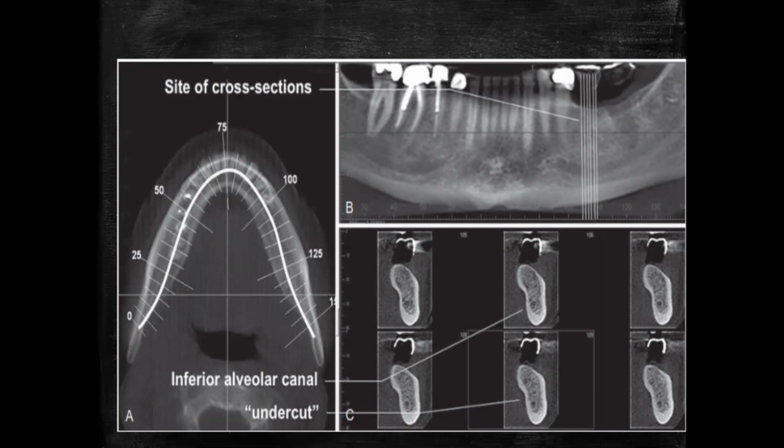The interslice distance means the distance between one slice and another slice. Imagine a bread loaf being cut by a knife. If the knife has a thickness of 2 mm, the distance between one slice and the other slice would be 2 mm. So this is how you need to understand that the interslice distance is 2 mm.